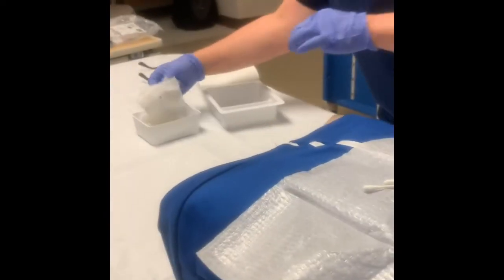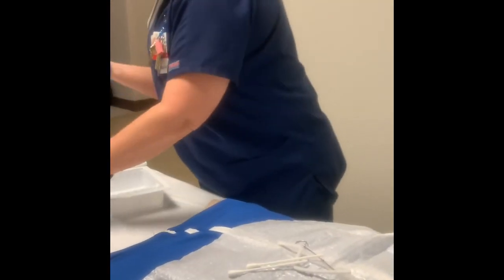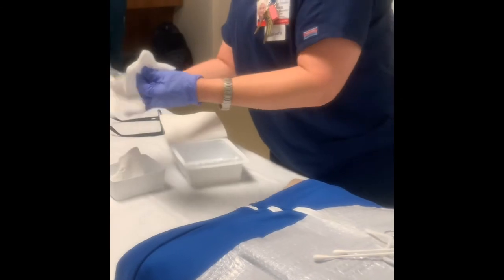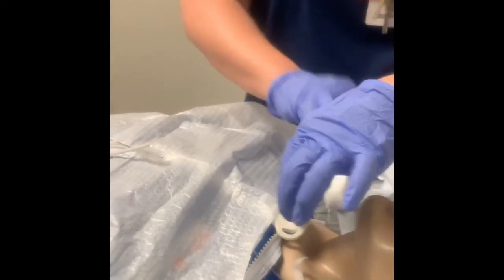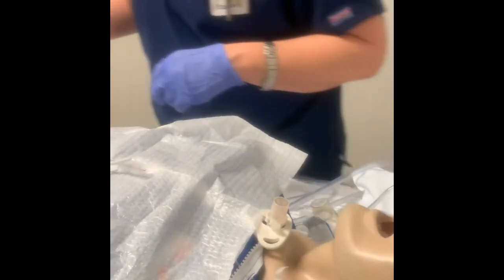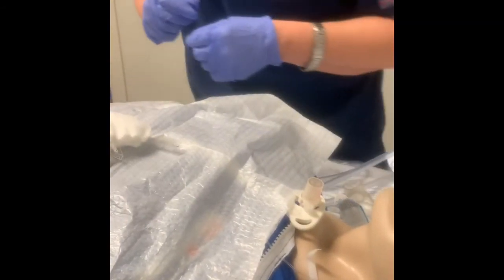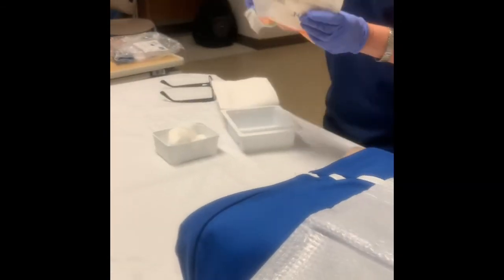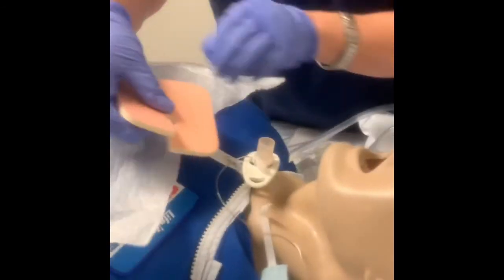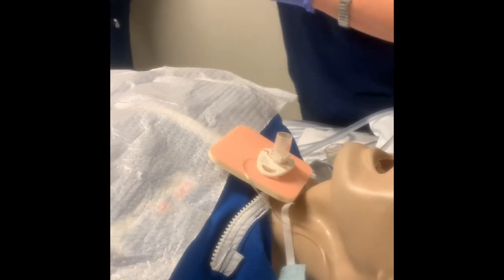Then in here, they're going to give you those soft wicks. I don't like these. I like my Allevyn, but it doesn't matter, it's fine. Then I'll put it in here, and then I like to clean around my trach, all around underneath here. Okay, so it's nice and clean. And then I will put my Allevyn underneath here, which is what I prefer. So I always like to have my Allevyn out. Then I'll put my Allevyn underneath there.